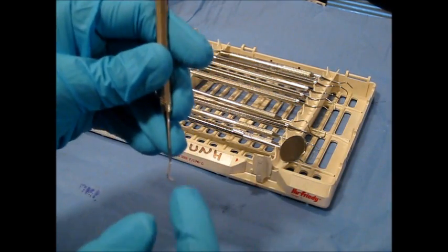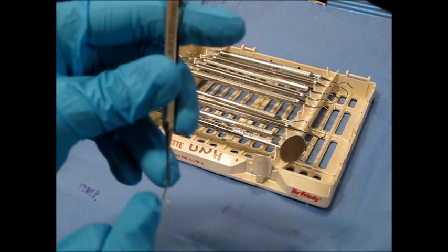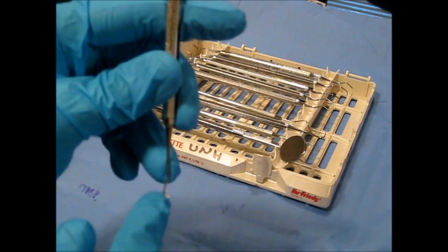It has a triangular cross section with a pointed tip end and a 90 degree angle from its face to the terminal shank.